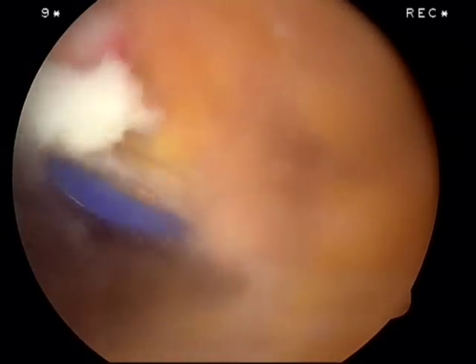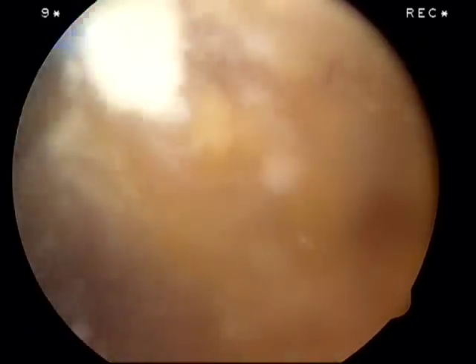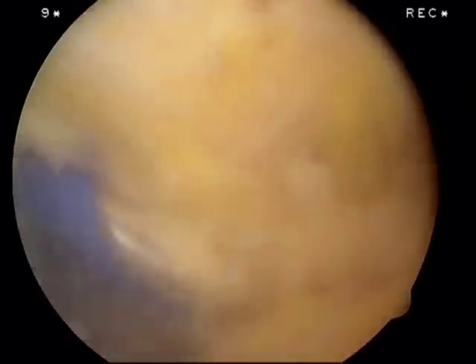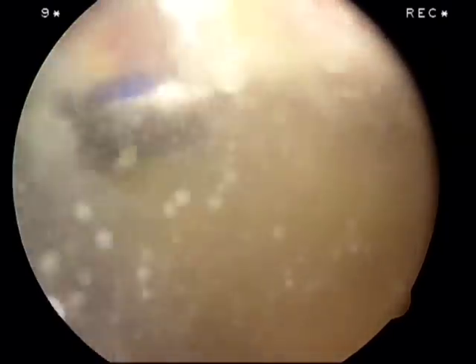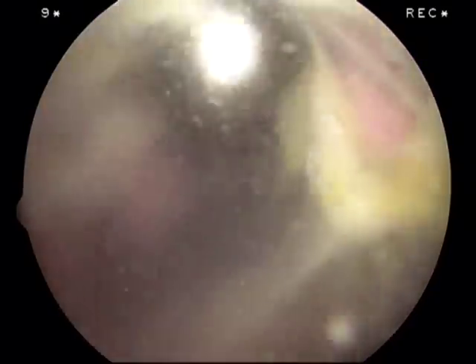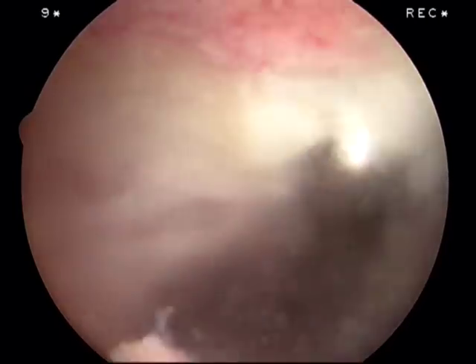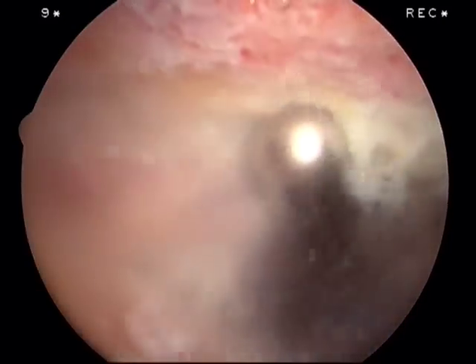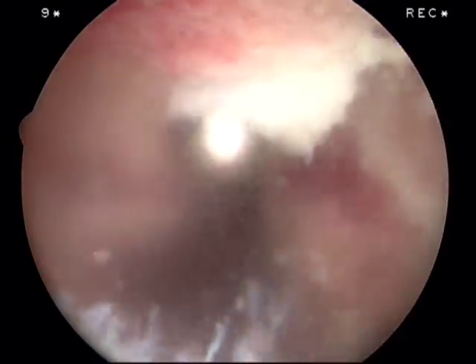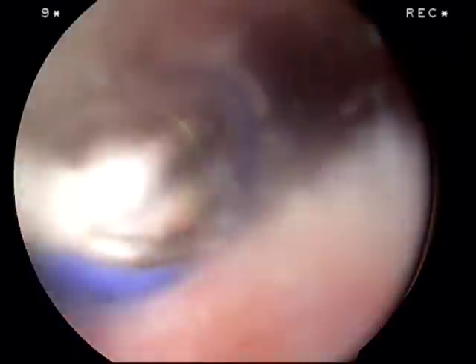Just chew it up, basically. I spot a bleeder — going after it and coagulating. It's nice being able to shave around a bleeder, knowing that if it starts bleeding you can coag it while you're doing it, rather than get a bloody field and have to come back with a cauterize device to find it. We followed the coracoacromial ligament up to the acromion and debride it off of there — a complete resection of the ligament, not just a release. And we're really done with the decompression portion.